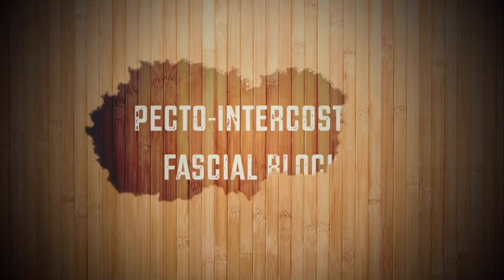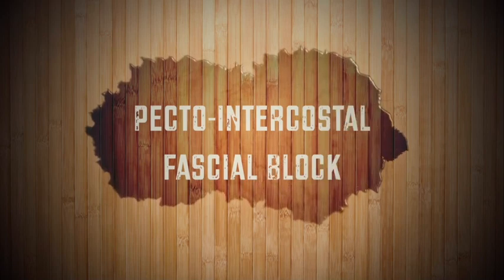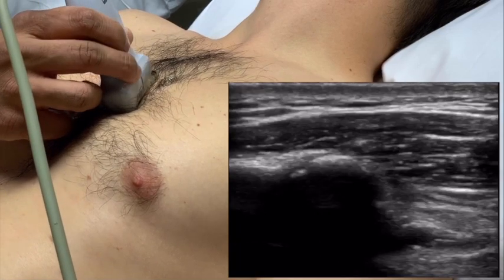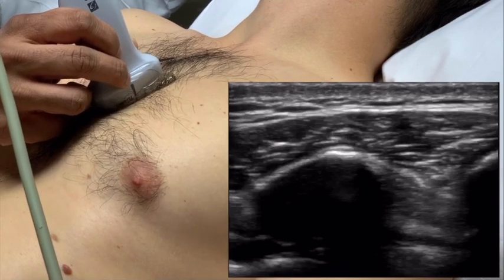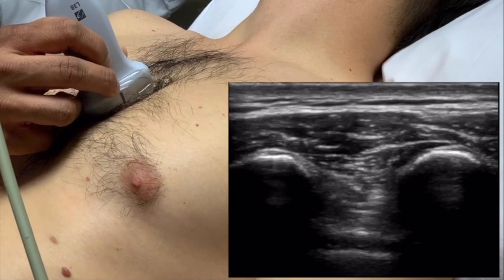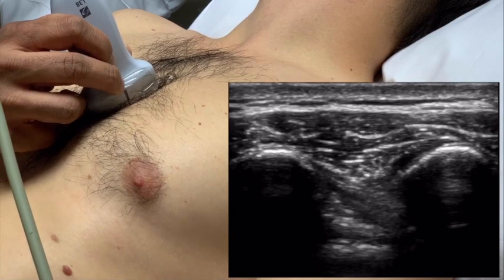And then the last component of a chest wall block is the PectoIntercostal fascial block. This is getting the anterior divisions of the ventral rami as they innervate the sternum and the medial chest. Here you're scanning just lateral to the sternum, and you see the costochondral ligament here. And if you go below that, you can do your injection right below the muscle.